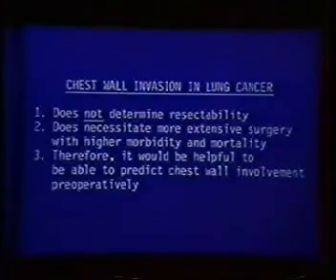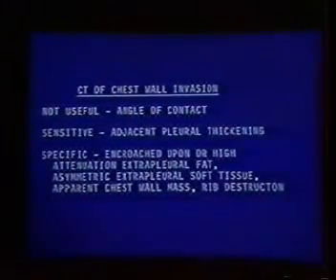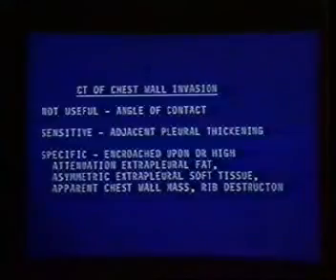So it is important to point out you're not talking about resectable versus non-resectable, but you are talking about surgery that has higher morbidity and mortality. So it would be nice to be able to alert a thoracic surgeon ahead of time that this might be a case where chest wall invasion were present. And we looked at a number of CT criteria. This has subsequently been done by other groups, including the group at Mallinckrodt.